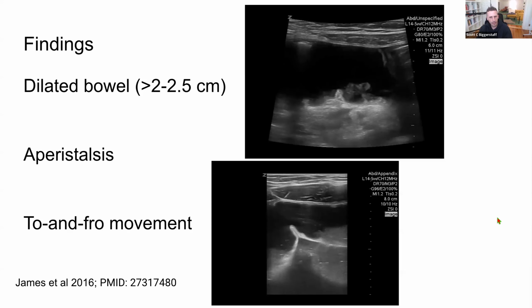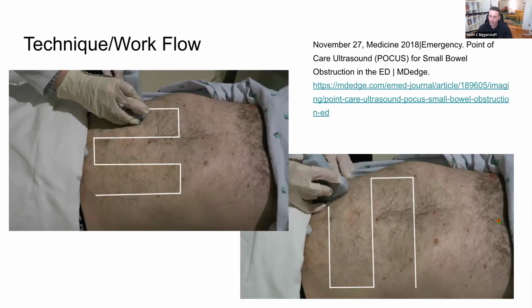For protocol, generally, again, it's a lawnmower approach. This is probably not a pediatric patient, and if it is, they might have early puberty or something like that.